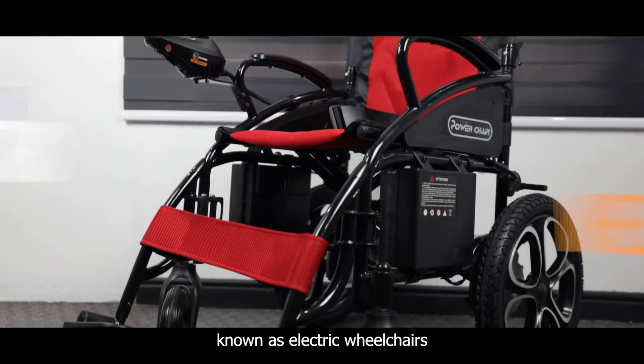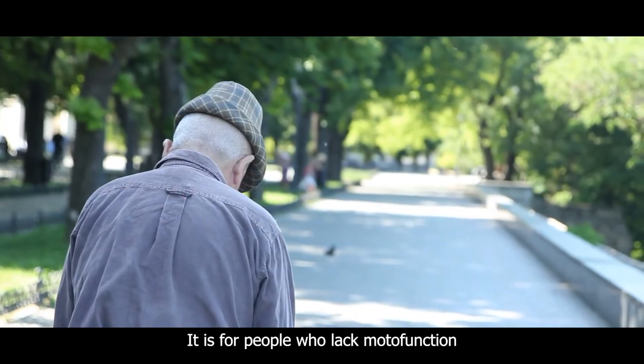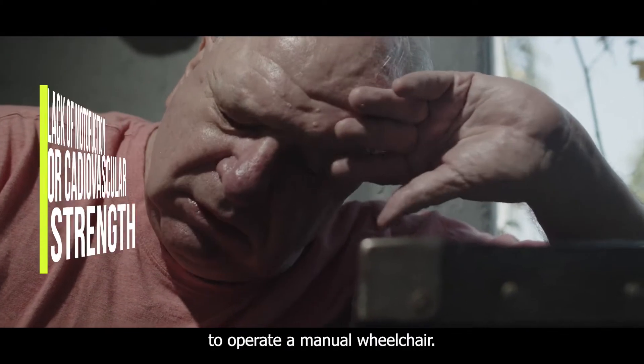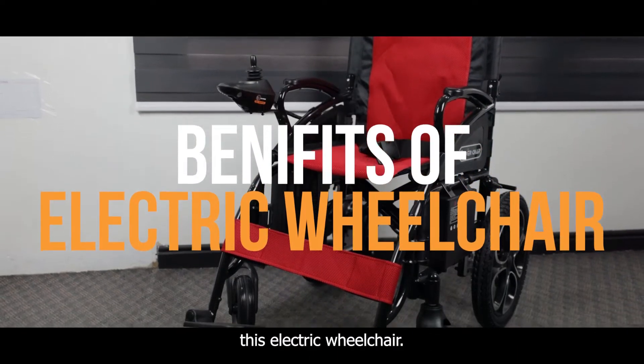Power wheelchairs are also known as electric wheelchairs or power chairs. They are for people who lack motor function or cardiovascular strength to operate a manual wheelchair. Here are some benefits of using this electric wheelchair.